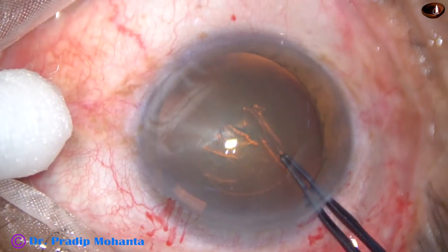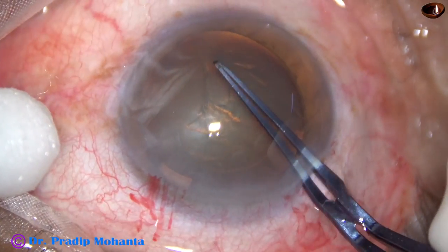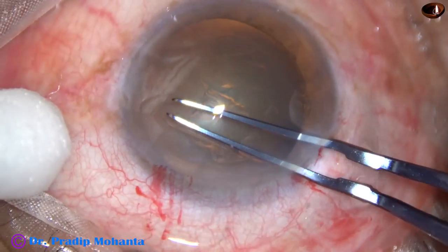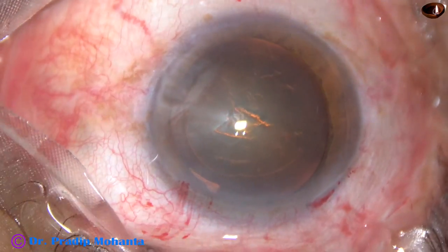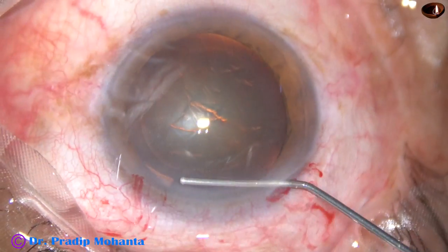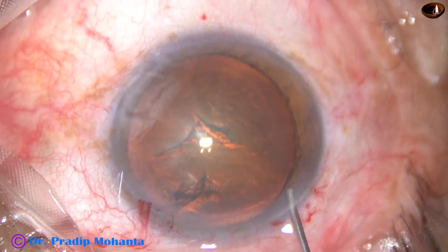I usually go anti-clockwise, remaining at a certain distance away from the margin of the dilated pupil and complete the rhexis. At this time, the anterior lip of the main wound is lifted up, and this causes less or minimal leakage of viscoelastic substance. Hydrodissection is done.